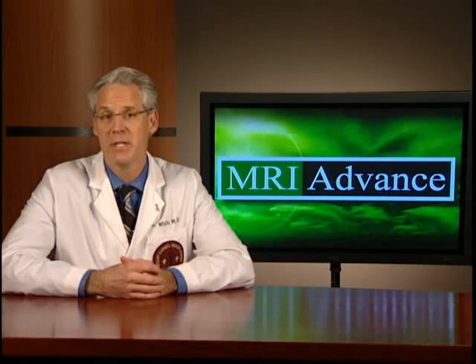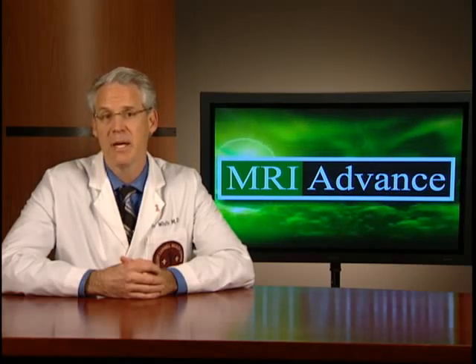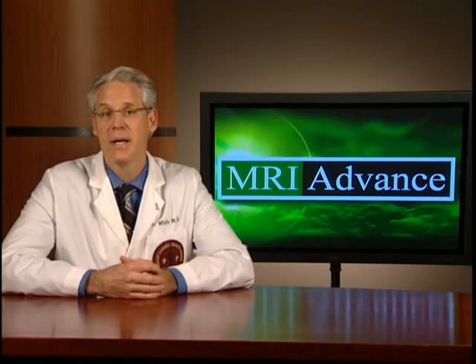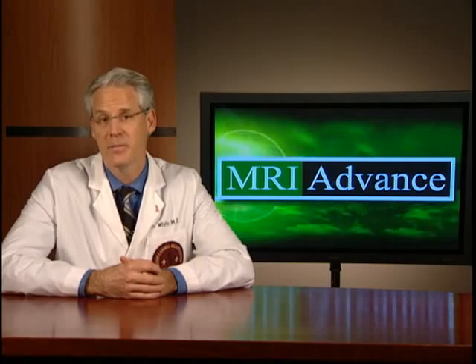Once we completed imaging of a number of known breast cancer patients, we had worked through many remaining problems in our workflow and had developed some degree of confidence in our ability to identify cancer. We then felt much more prepared to proceed with routine diagnostic imaging.